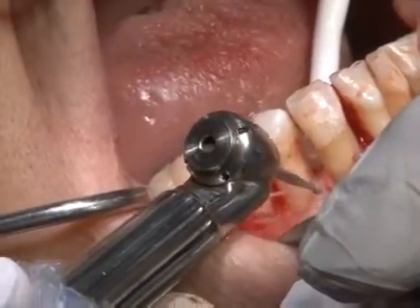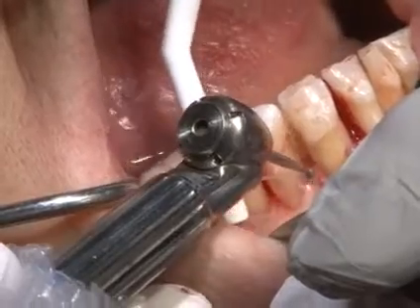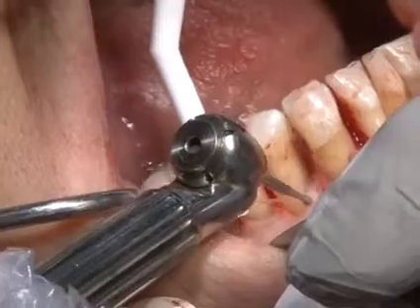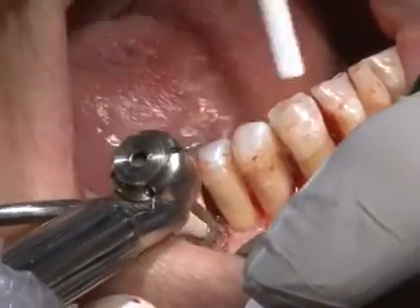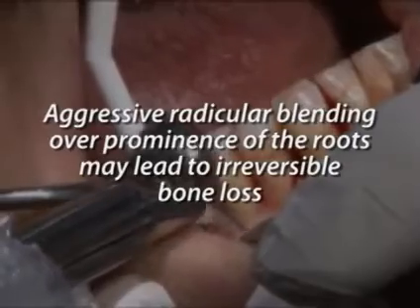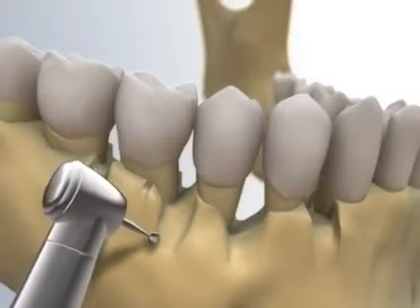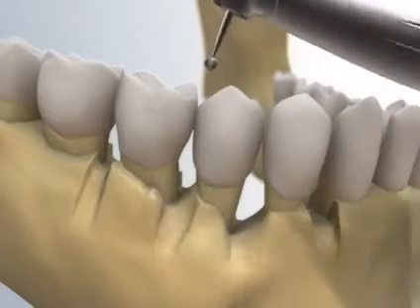Thinner alveolar bone allows flap placement to assume a more knife-edged margin and helps in the reduction of probing depth. Care must be taken when blending over the radicular bone because the facial or lingual bone over the root surfaces is often thin. Aggressive radicular blending over the prominence of the roots may lead to irreversible bone loss. On tooth 4-6, osteoplasty is performed on the buccal and lingual aspect of 4-6.